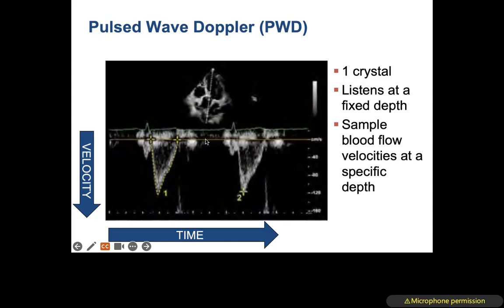As you go through the cardiac cycle, this will tell you the velocity of blood during that time, right? So when you're not in systole, there is no velocity of blood because no blood is necessarily going through that left ventricular outflow tract. This is a negative Doppler shift because the blood is moving away from my transducer. And if you look at this picture, this is what we call a scooped out waveform. It's black in the center because here, this line is showing us the velocity of blood. This is traced because when we talk in our further lectures about obtaining cardiac output, we can trace that to look at our stroke volume. But for now, I just want you to recognize that this is using pulse wave technology to look at the velocity of blood at a specific location.